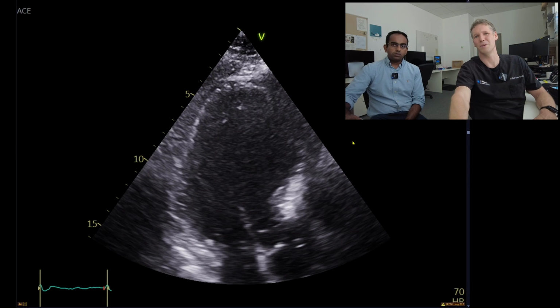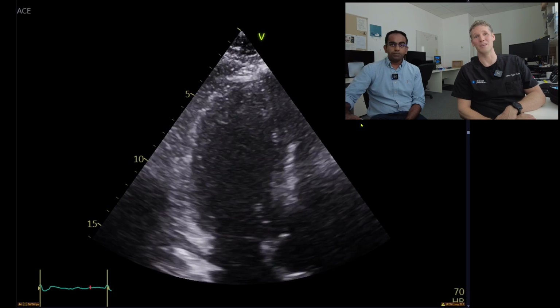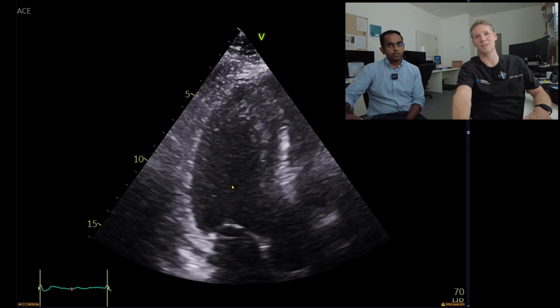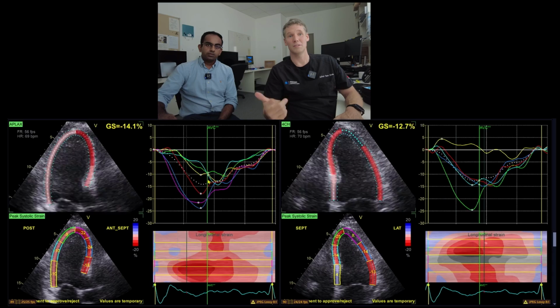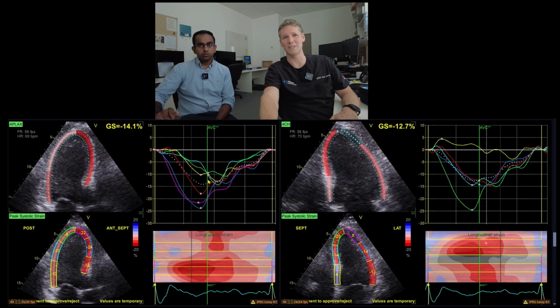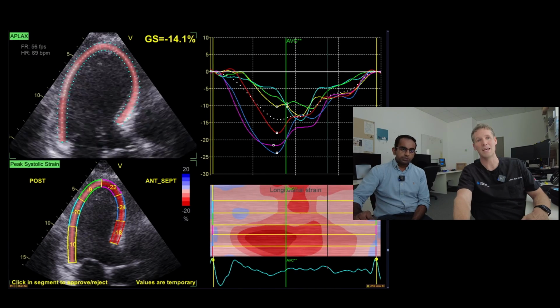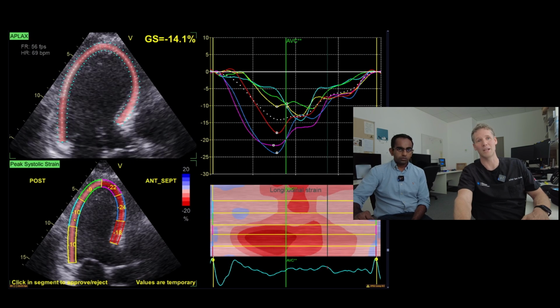And the 3-chamber, it's down, right? Those basal and mid levels, it's just like the parasternal long that we were looking at. So we're looking at the inferolateral segments and the anteroseptal thickening nicely, and those two are down. The last thing we can see at the end of this, the subcostal views weren't great, so sorry, just to skip over those. What we can see down here is the sonographer has done strain analysis, and I won't go into strain analysis too much more, but each segment is analysed in a separate manner, and the colours go accordingly with each segment.